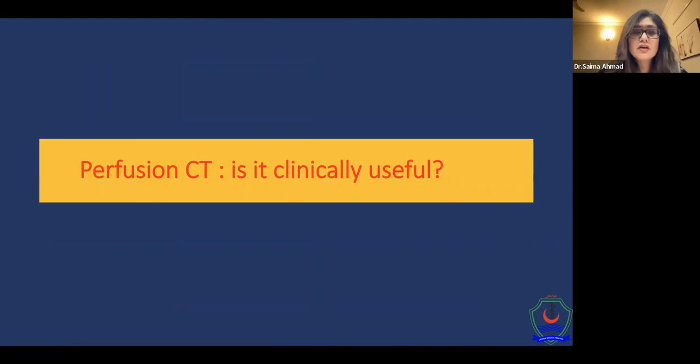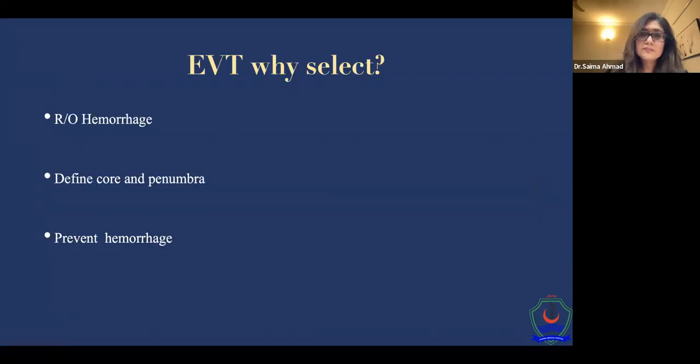There is an ongoing long debate about the perfusion CT, whether it should be performed or not. As far as EVT is concerned, we select the patients on the basis of the hemorrhage, and then we have to define the core and the penumbra.